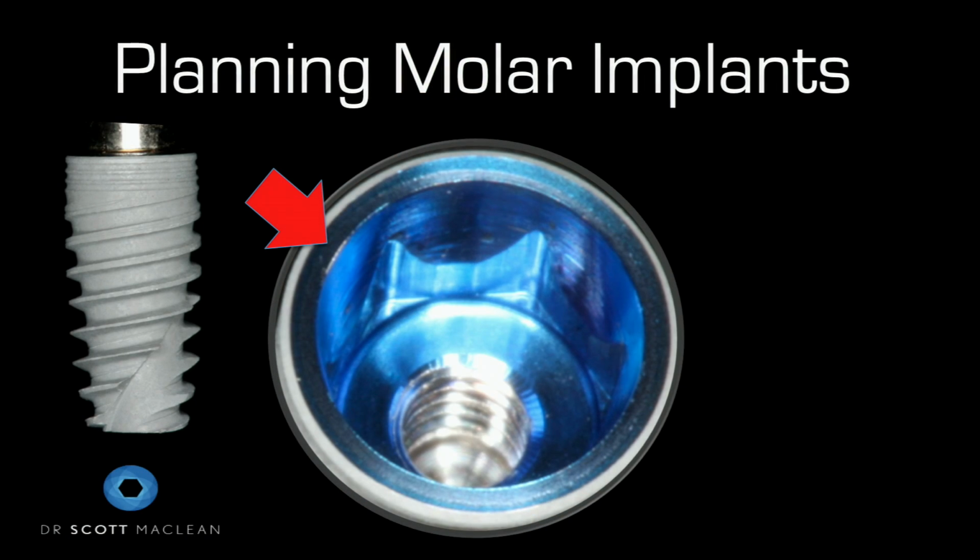If we look at this particular implant, what I like to choose is something that has a platform shift. Inside, it will have a conical connection, which is usually a great thing to have on a posterior implant. And lastly, we can see down inside a hex, which is an anti-rotational hex. This implant is new to the market, but I like it because of the features and benefit it offers.